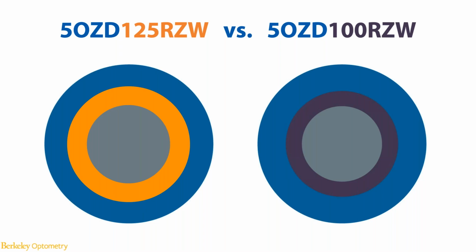So our general goal is to really understand the performance of CRT lens in a smaller optic zone diameter. But the next immediate logical question to ask is, for that 1mm smaller in the optic zone area, where does that extra 1mm go? Do we want to have it all contributing to the landing area, or do we want the return zone width and the landing zone area pretty much to share this extra 0.5 millimeter on each side?